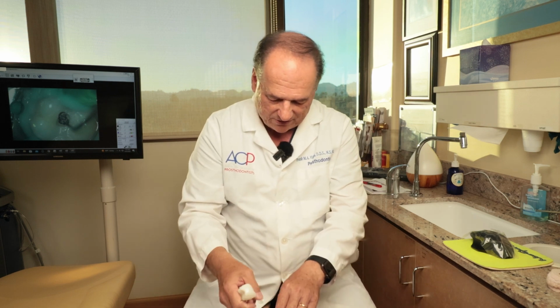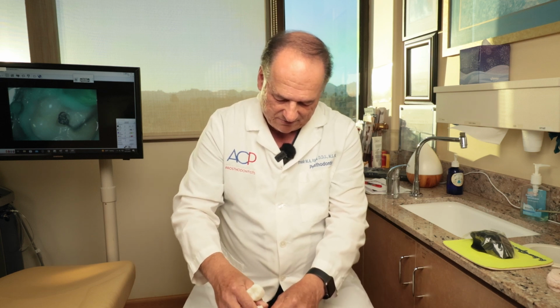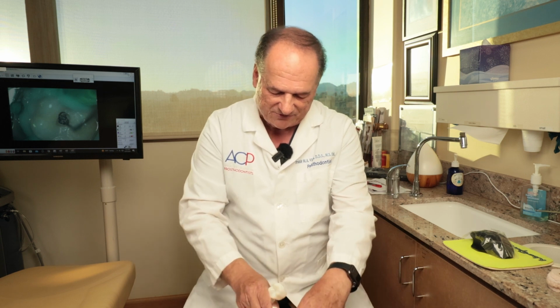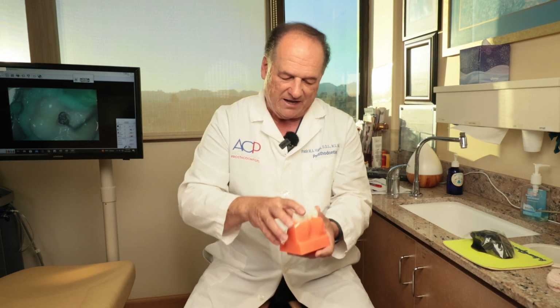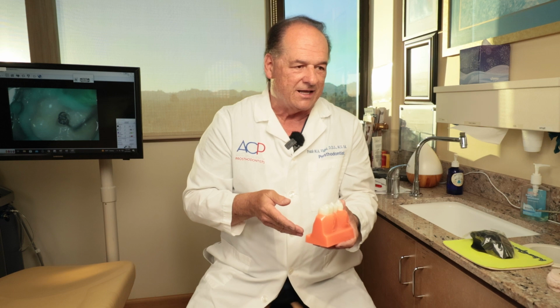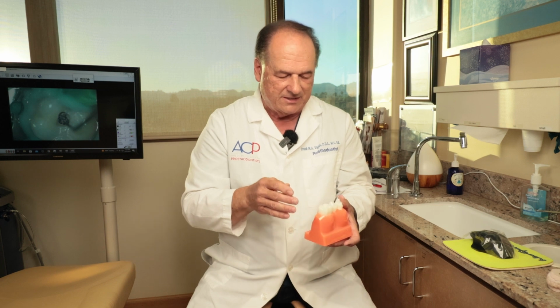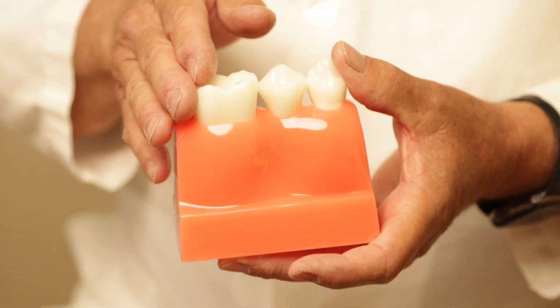Bridges are difficult to maintain. Why? Because they connect teeth. And like I said, dentists and patients are very familiar with cemented bridges. But when you have a bridge, now you have to go in between and clean them. And if this is in the very back, and if you're not really committed to keeping this clean, they tend to fail.